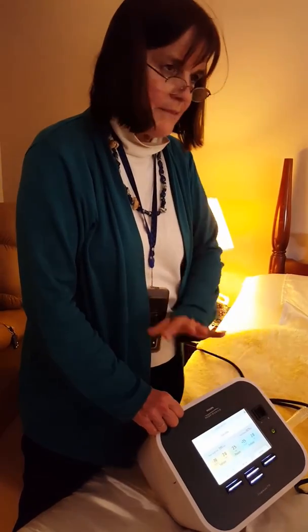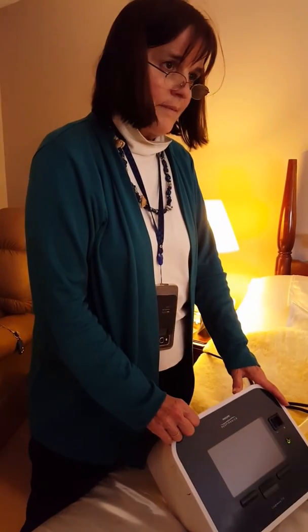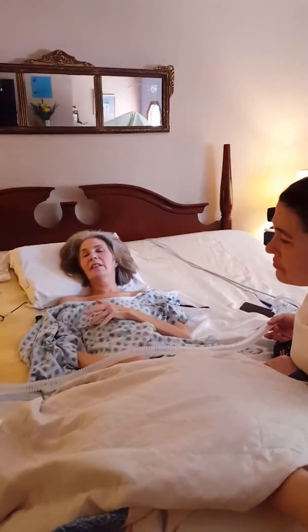Standby gives you time to take a break. And then to turn the whole thing off, it's the round button.